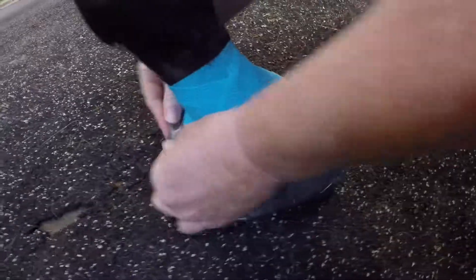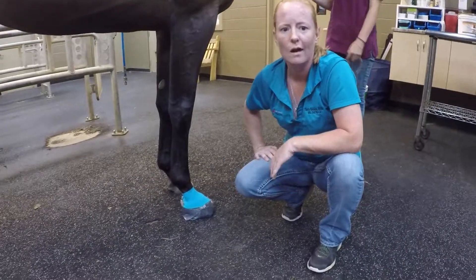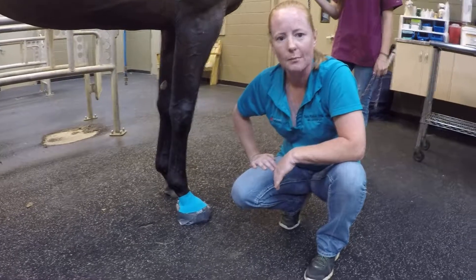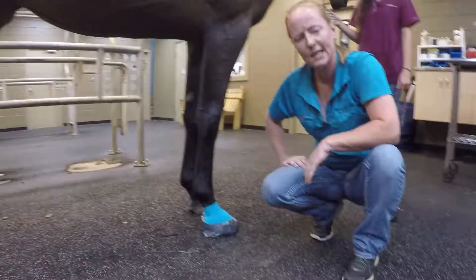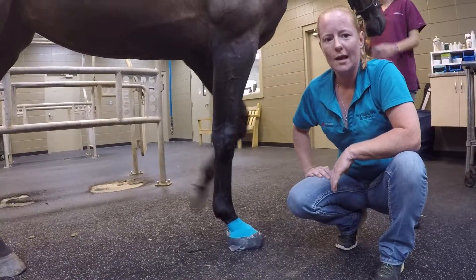Any time we have you do a foot bandage we may alter things for the specific case that your horse has. So whatever happens to be going on with that foot, we may change some things up. But this gives you an idea of just a very basic foot bandage, which is a nice thing to know how to do.